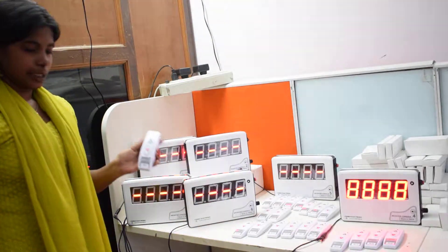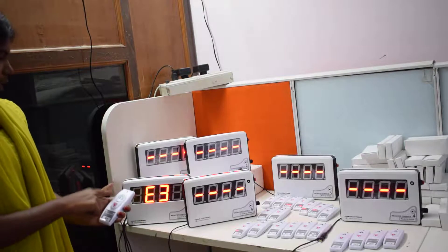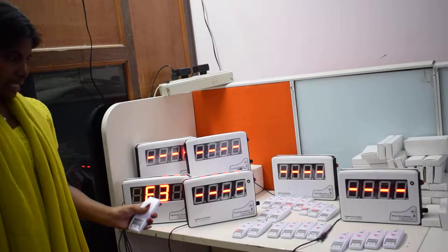This is the remote. This is a call button. If you press the call button, it will be automatically displayed. The numeric number will be displayed. This is the cancellation button.